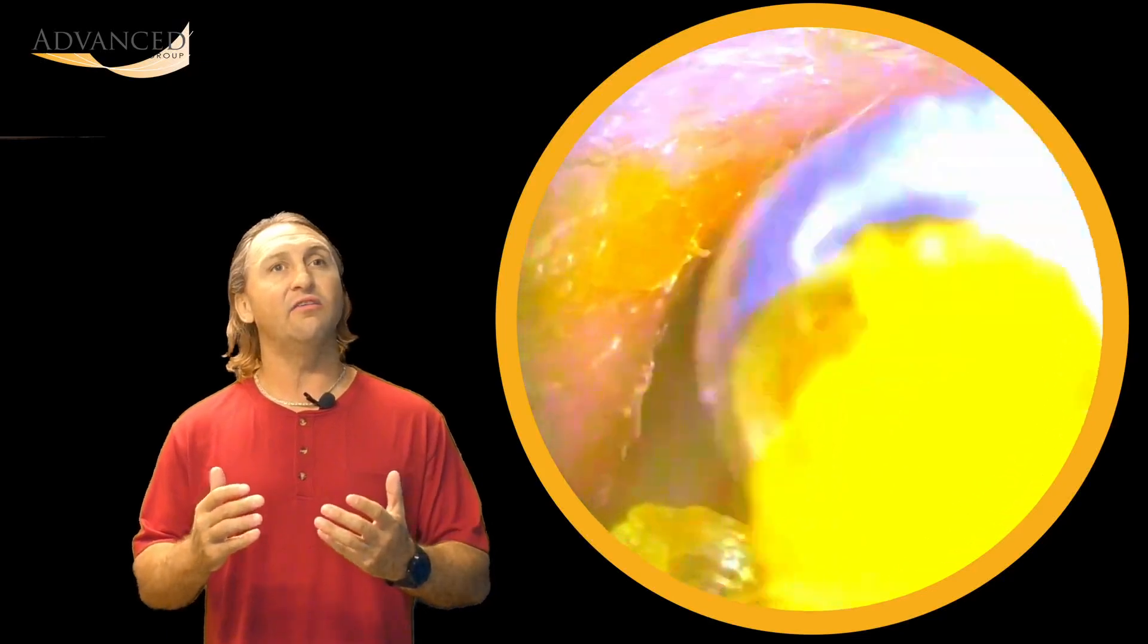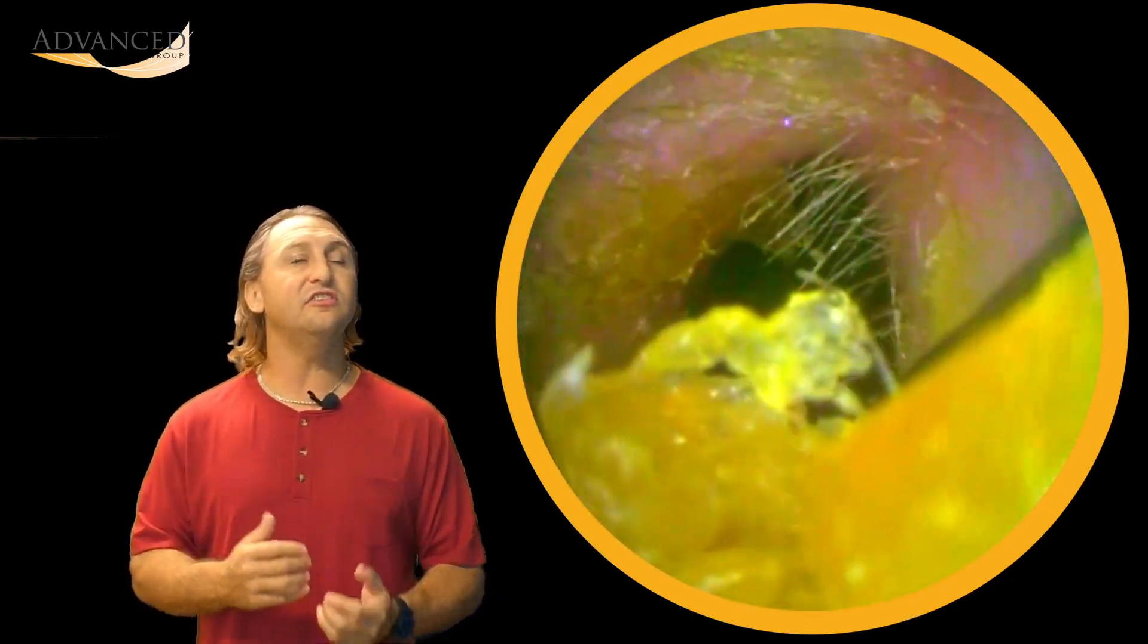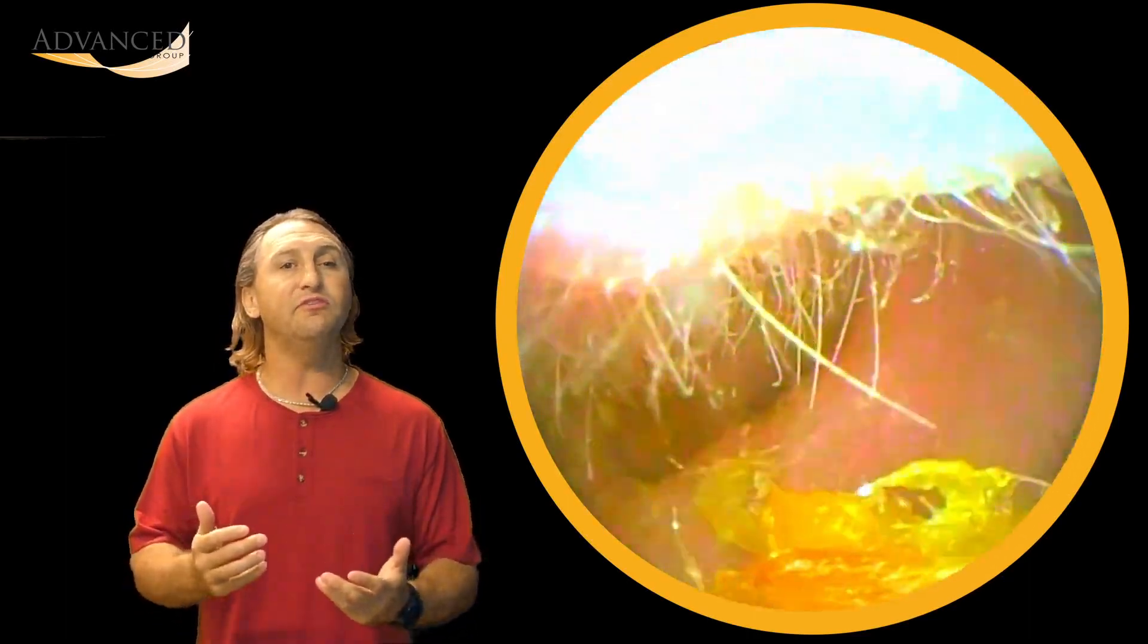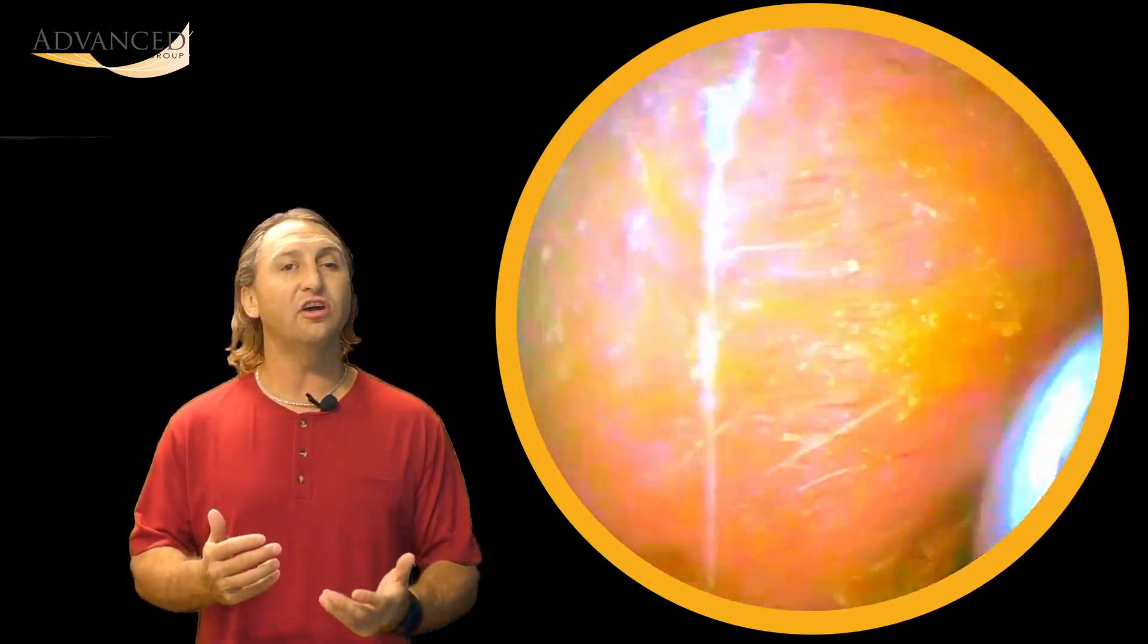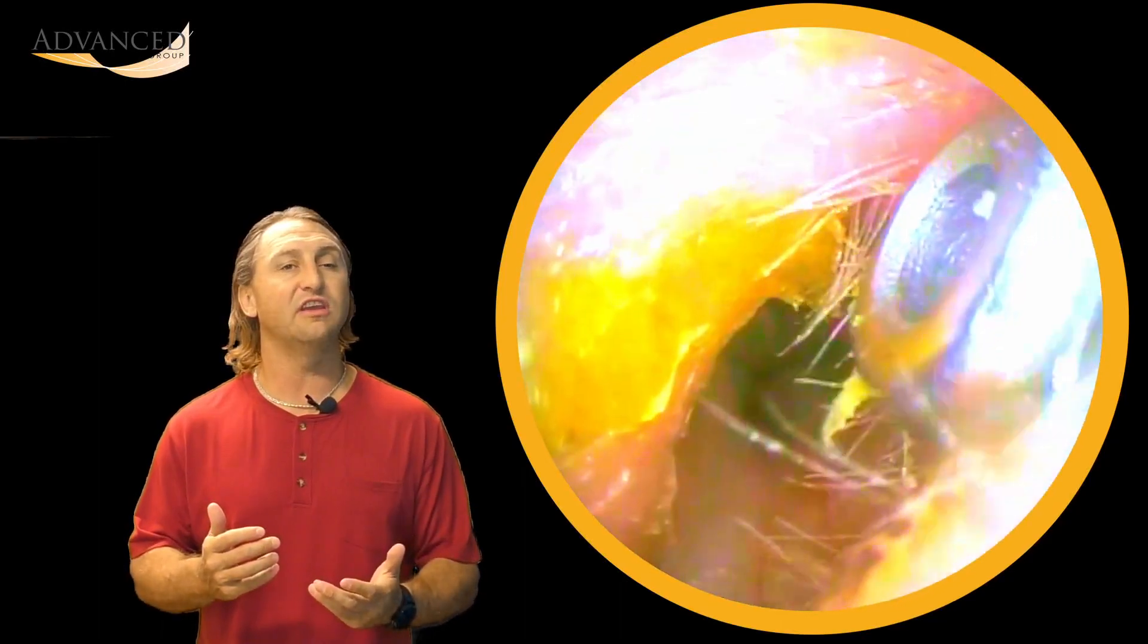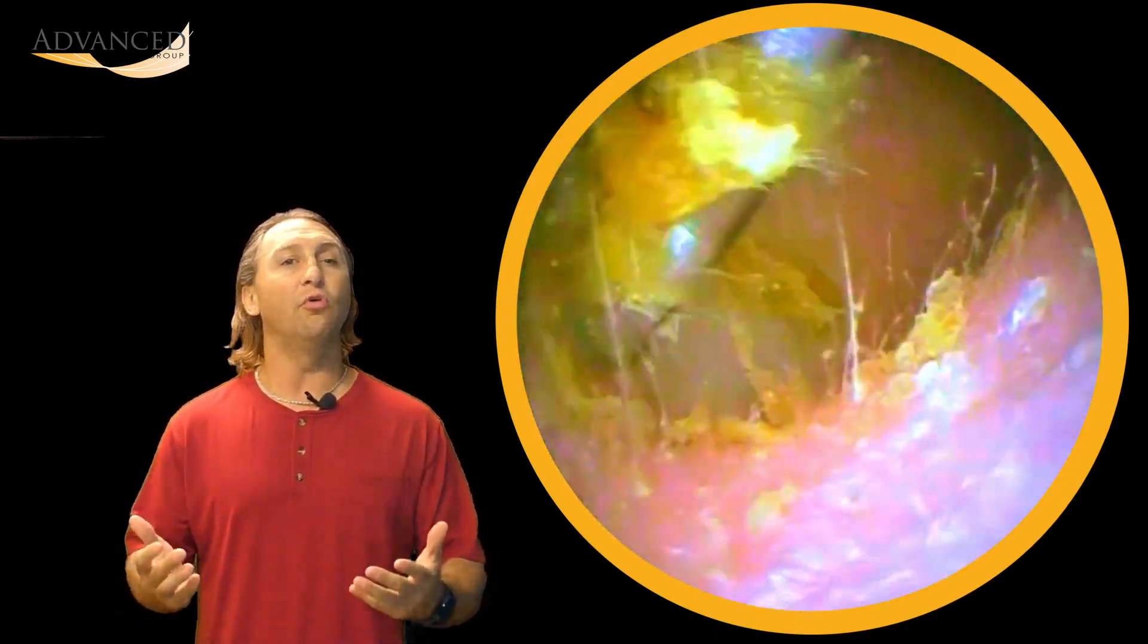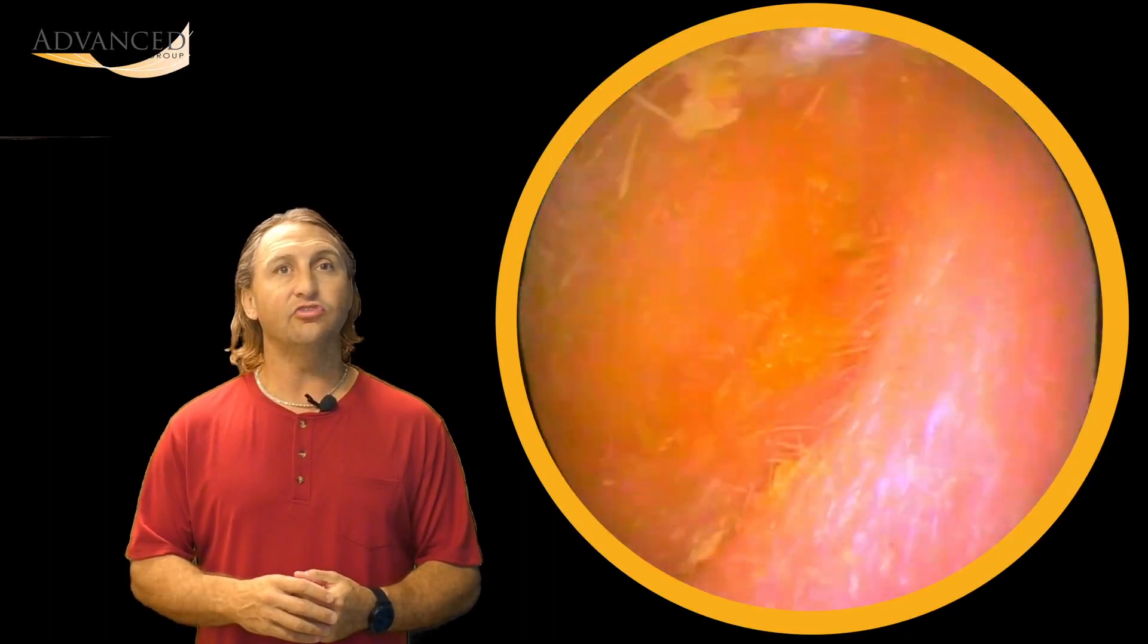When patients have collapsing ear canals, it doesn't take much wax to really affect their hearing, making their ears feel completely full and having a great reduction in the amount of hearing that they can perceive. So what we're gonna do is use the curette to remove this wax, opening up the ears, making them feel more open and improving the hearing dramatically.